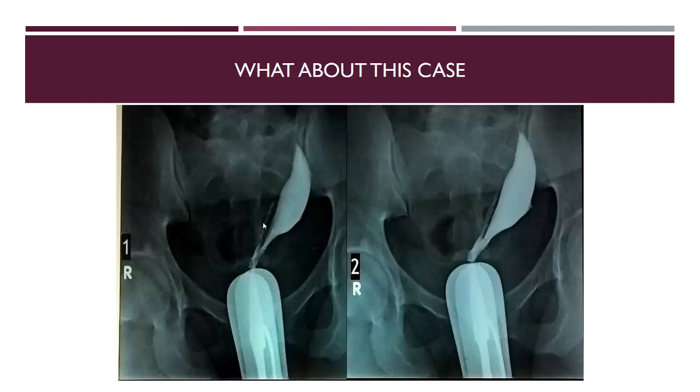Again, this is a large uterine cavity and it is pushed to the left side. But here, when we push the uterus, we found that there are two openings of the fallopian tube here. This is one and this is another one. So this is a misplaced uterus, but is enlarged, and it may be due to fibroid also.